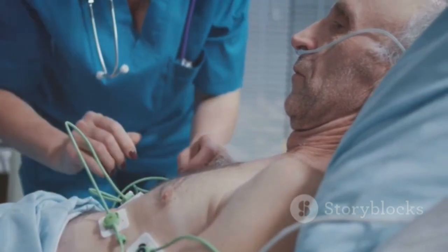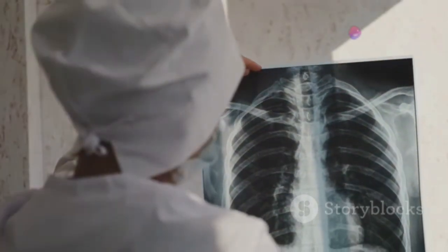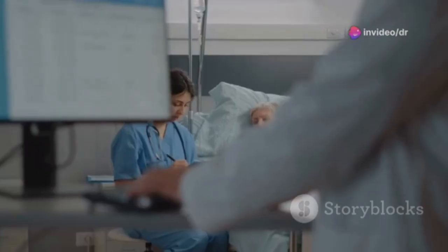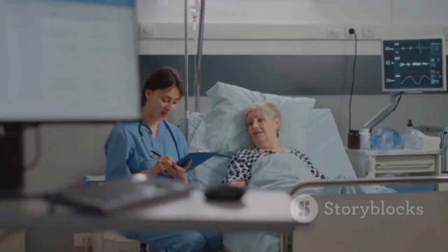Post-insertion care. Monitor the patient's respiratory status and chest tube function. Regularly check for signs of infection, blockage, or air leaks. Obtain chest X-rays to ensure proper placement and lung re-expansion. The duration of chest tube placement depends on the underlying condition and patient's response to treatment.